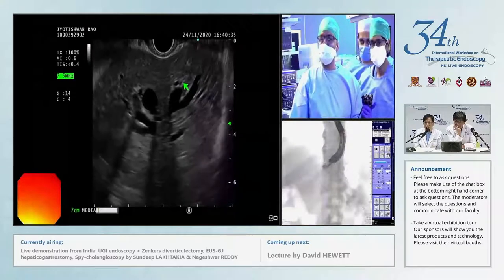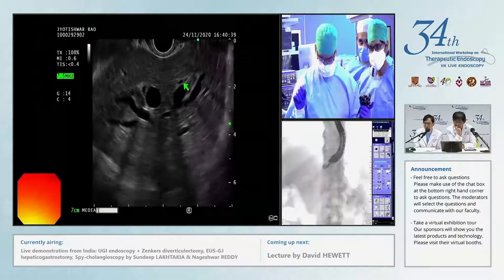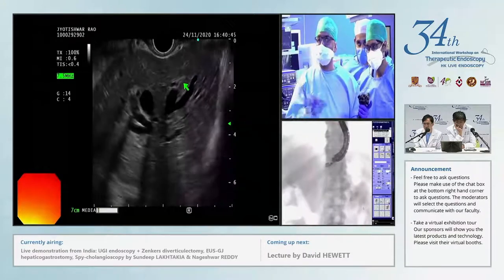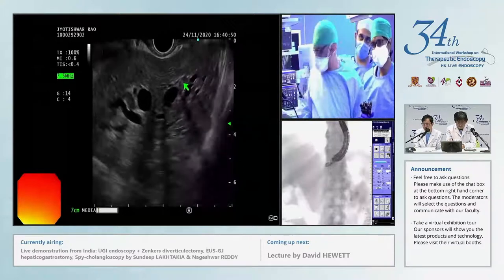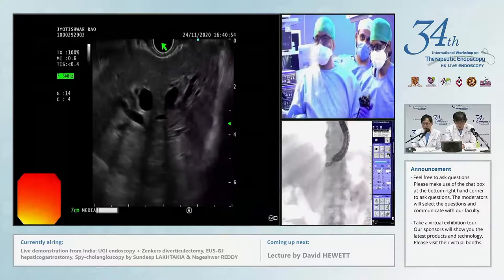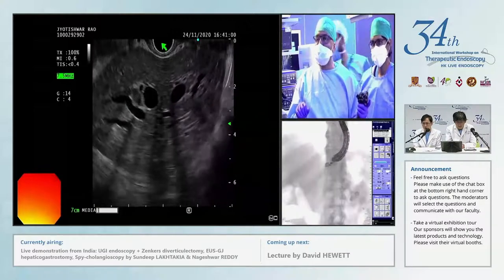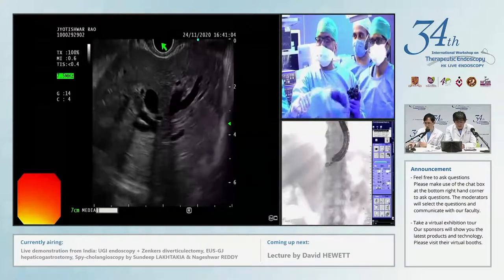It's good that you demonstrated balancing the different views, because now you get all the views balanced. You have a good scope position. You're pointing to the hilum, and you're not too close to your heart or your diaphragm, so it's looking good on all the screens. I'm using a hook needle, 19 gauge, the stylet has been removed and it's primed with contrast and saline.